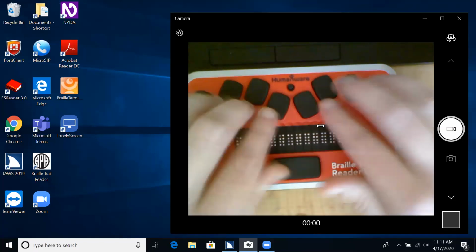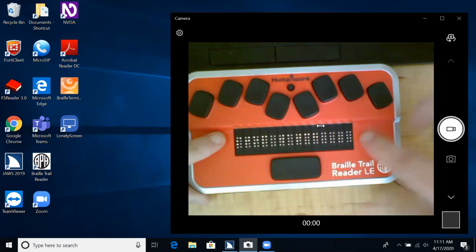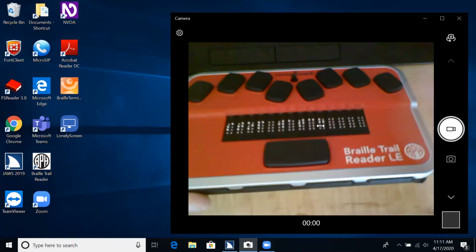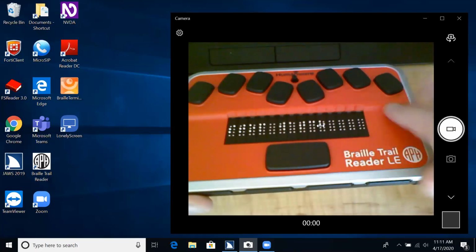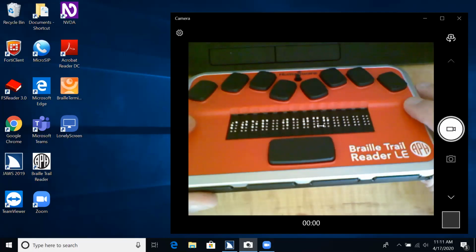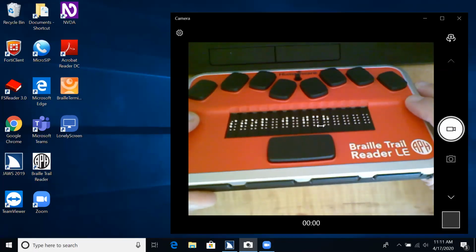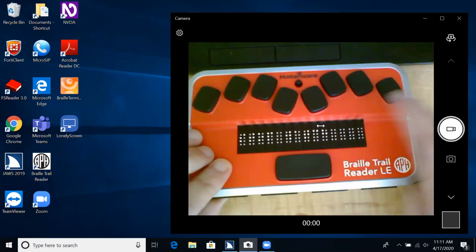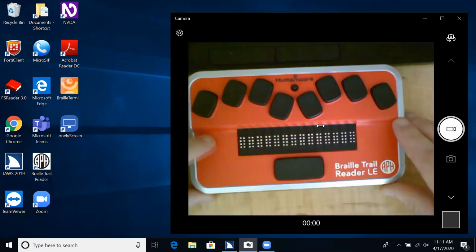Your Braille keyboard is on the top. You will also have the 14-cell Braille display, and right above each Braille cell, there is a cursor router sensor. These are not buttons, they are grooves, and they will give us the ability to route our cursor to a specific cell or to activate an actual item that we have in focus, and we'll look at this when we use the iPhone.